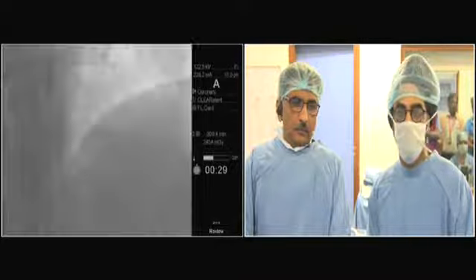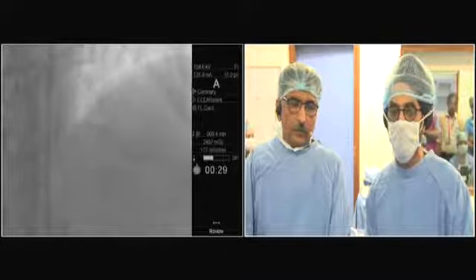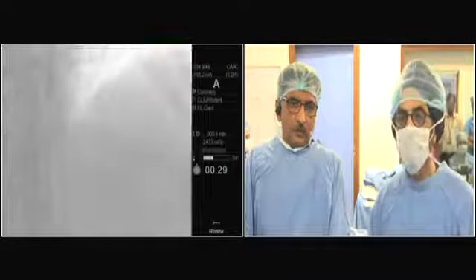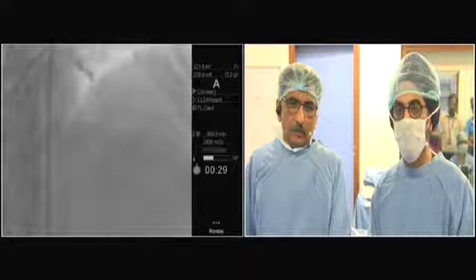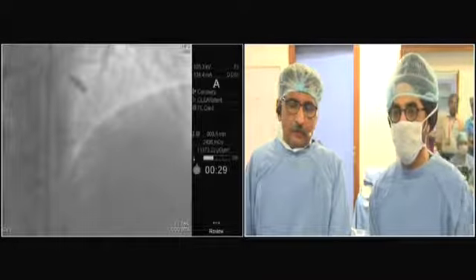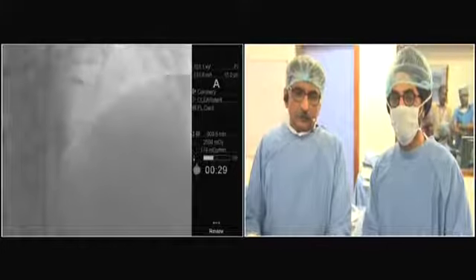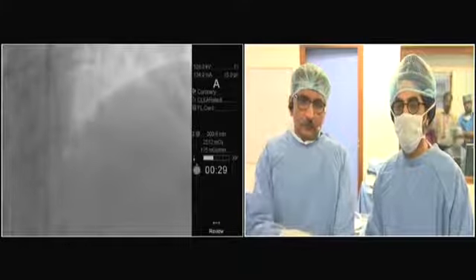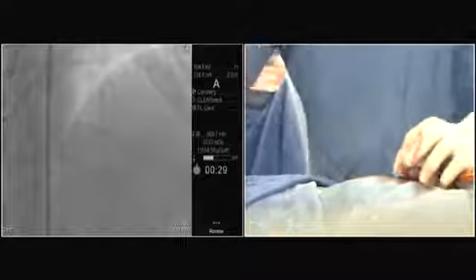So is this a 4 balloon? Yeah, 4 non-compliant. It's a 4 by 6? I think these 6 millimeter balloons are very useful for the POT technique, when you don't want to involve, for example, a more proximal branch or to do a geographic mismatch outside the stent. Don't you think that the proximal part is more than 4? Yeah, it was 4.5. Probably more than 4, yeah.